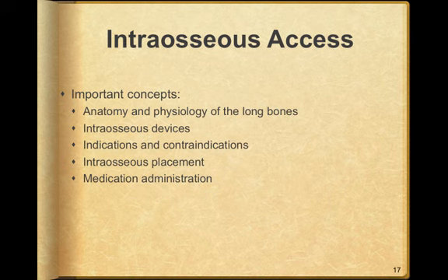Indications and contraindications. If somebody has broken bones, or the bone that you're putting this in is broken, that would be a contraindication. There's some other ones as well. Osteoporosis may be a consideration. Osteogenesis imperfecta is another consideration of a contraindication.